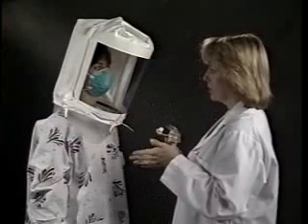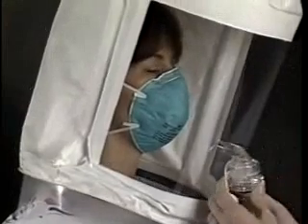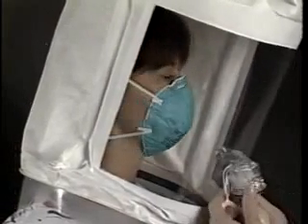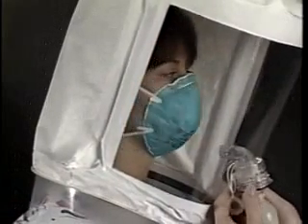First, have them breathe through their mouth normally for 60 seconds. Second, have the subject breathe deeply through their mouth for 60 seconds with the breaths deep and regular. Third, instruct the subject to breathe through their mouth normally and turn their head side to side, pausing momentarily to inhale at each side.